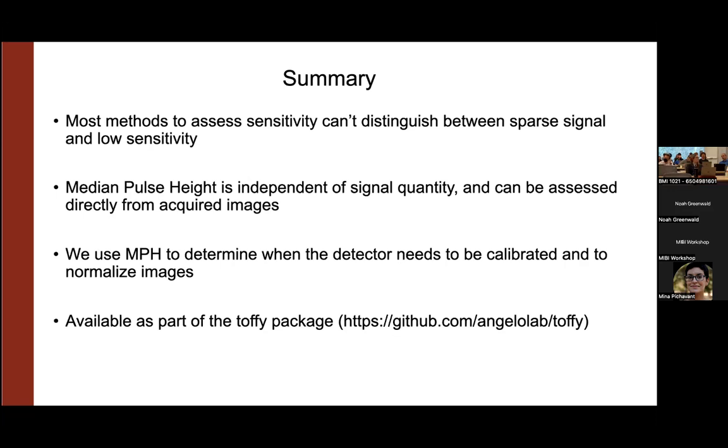And that's definitely something we could revisit if the need arises. I think at this point, even in the clinical cohorts where we're looking at archival samples, I guess we don't know whether it appears to have been a source of systematic bias. But if we start to see evidence that it is an issue, I think there are ways that we could have internal standards that try to at least flag problematic samples, if not try to normalize it.